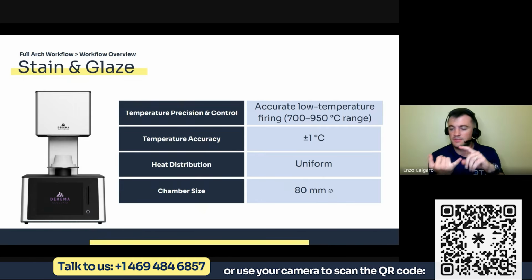And that depends on the material, on the heating elements. It depends on a lot of things, and you have to talk to some specialists to really figure out what the differences are. That's why you have maybe $2,500 ovens and $15,000 ovens. There are a lot of differences there.